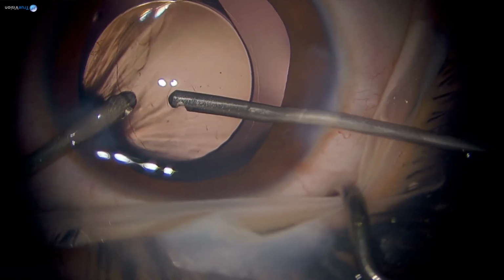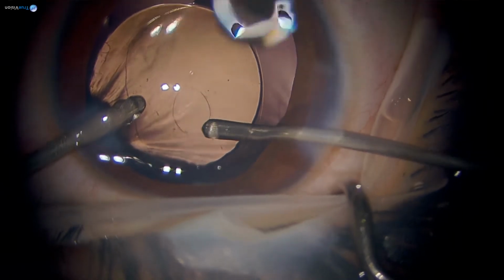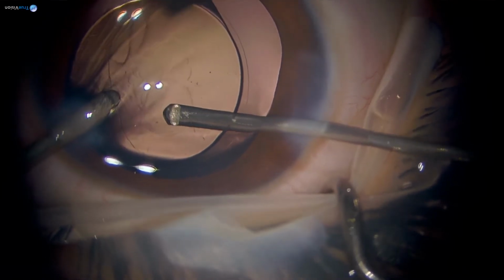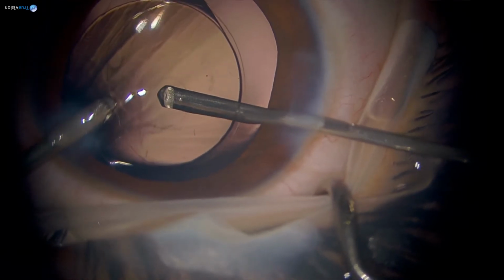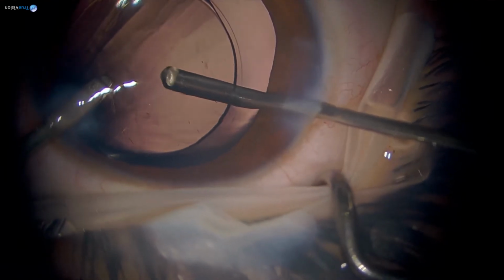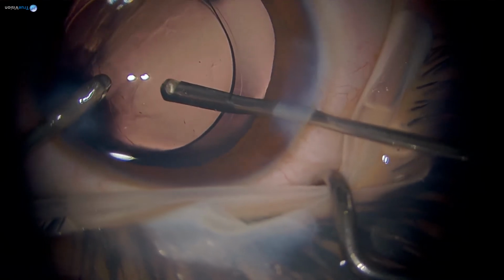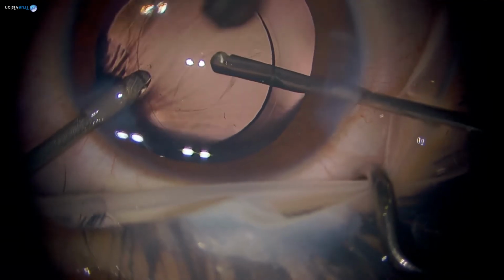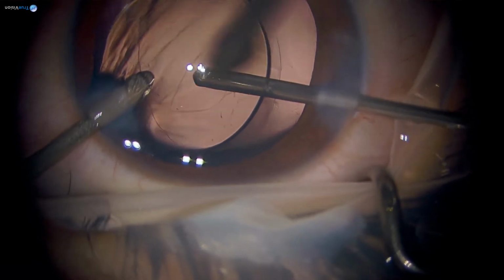You can see that opening there. So this is my initial opening. So I go low cut rate, and then as I go inside, I increase the cut rate. Now I'm close to 3000. And again, you don't feel a need to go very far deep into the vitreous. Look at the level. I'm just behind the capsule.